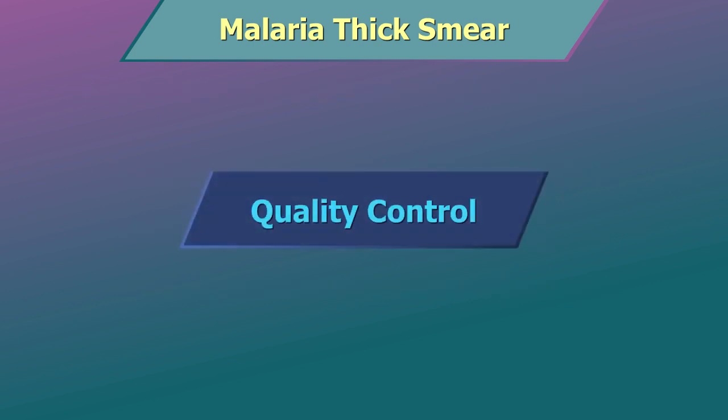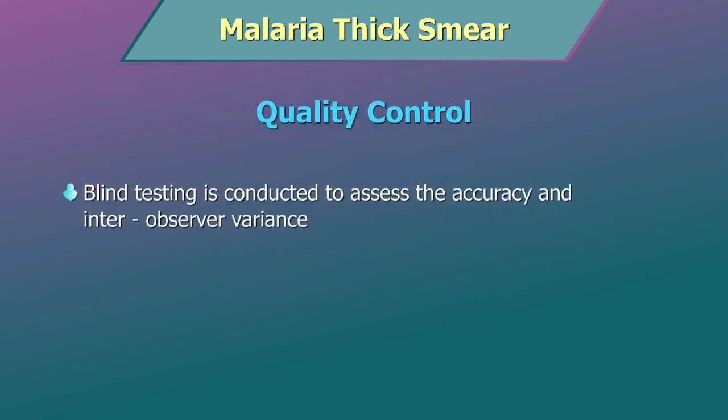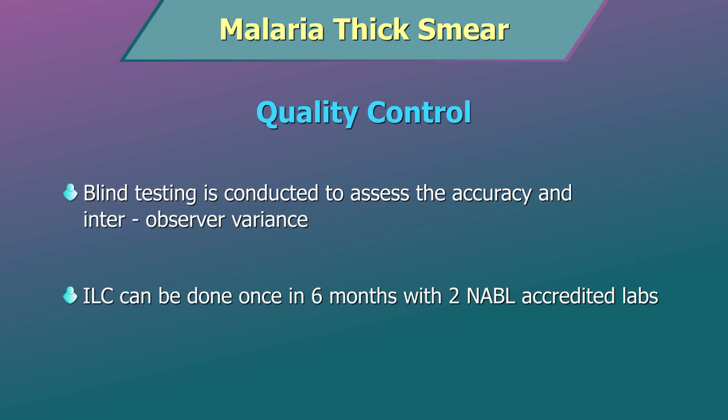Quality control. Blind testing is conducted to assess the accuracy and inter-observer variance. If feasible, inter-lab comparisons can be done once in 6 months with 2 NABL accredited labs.